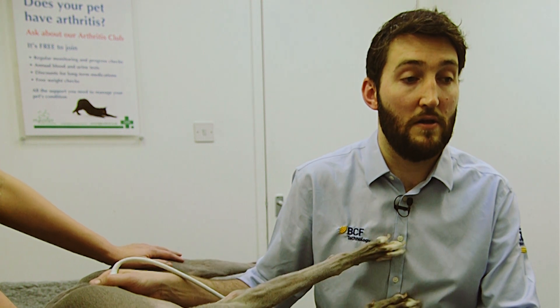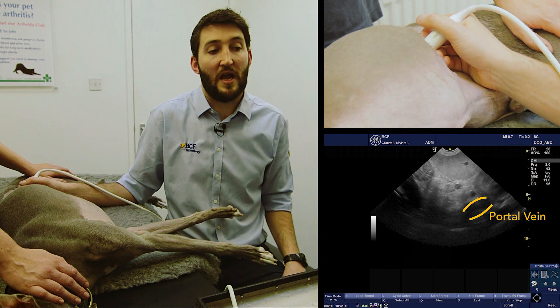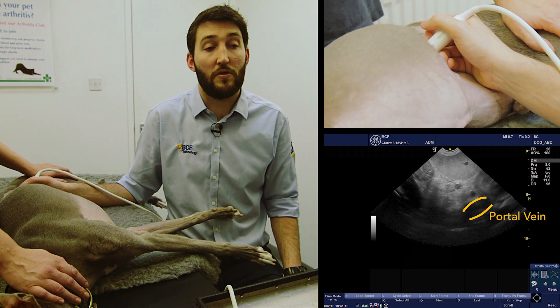Let's try that again — we fan up and come up the body wall, looking for the appearance of the portal vein. Again we can see the portal vein on the bottom right of the screen.